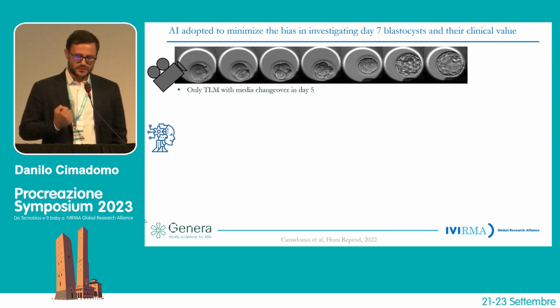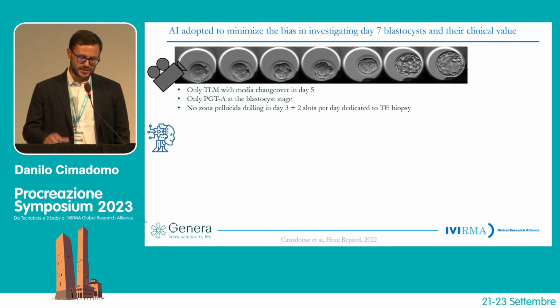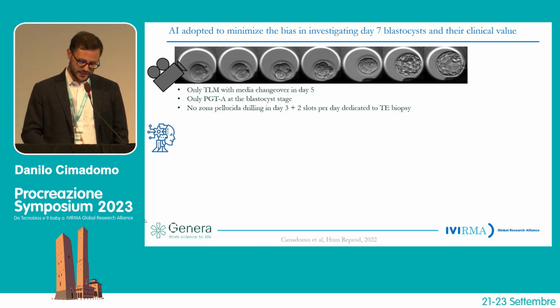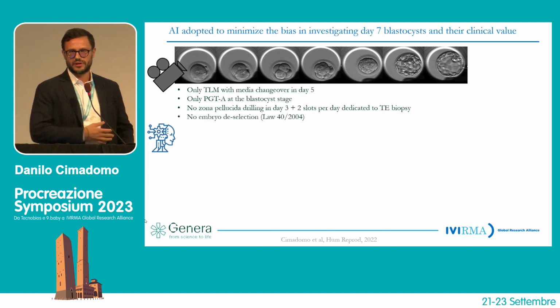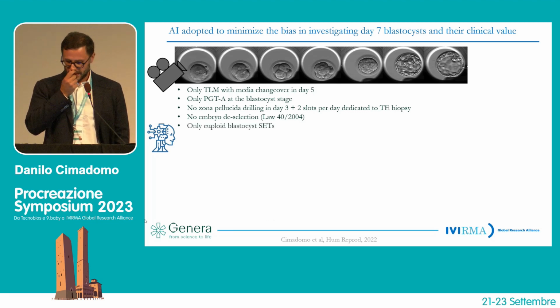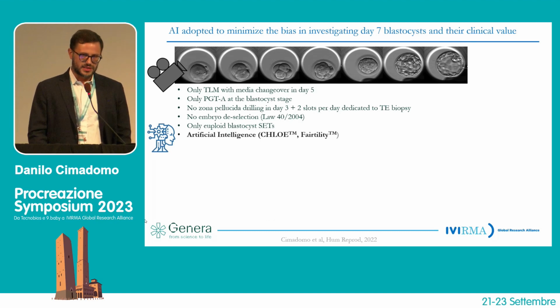So we conducted our own study, published in 2022, in which we included only time-lapse videos with media changeover on day 5, only PGT-A at the blastocyst stage, and no zona pellucida opening. So the embryo is completely enclosed in the zona pellucida until it reaches full expansion. There was no embryo deselection because, under Law 40 of 2004, we are not allowed to deselect embryos, so any embryo was included. And there were only blastocysts, euploid single embryo transfer.